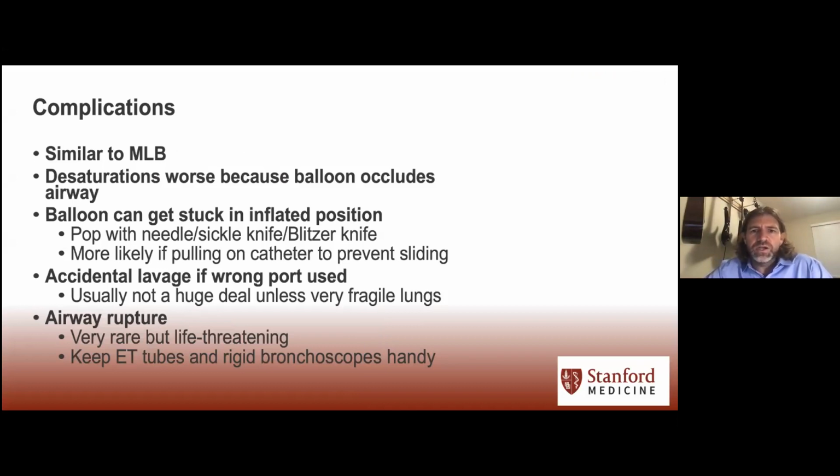The balloon can get stuck in the inflated position, like I've alluded to. One of the things that I've actually done that's quite easy, if you don't have a sickle knife or something sharp to poke through the mouth, is you just take an angiocath, stab it straight through the neck, and it pops the balloon, just like that. It's, again, something that's gone by the wayside with the Bryan Medical balloons for the most part, but many balloons are out there which still have this potential issue. So something to keep in mind.